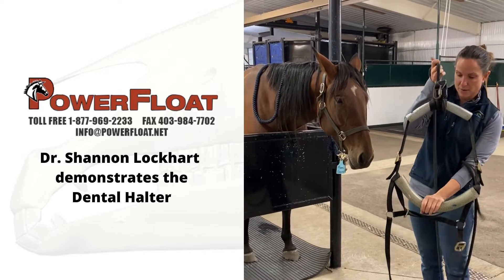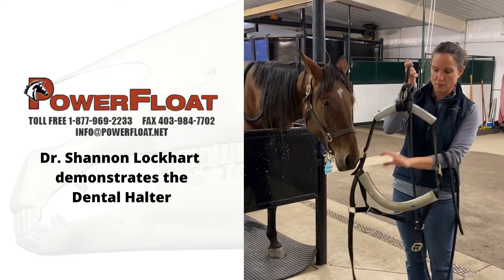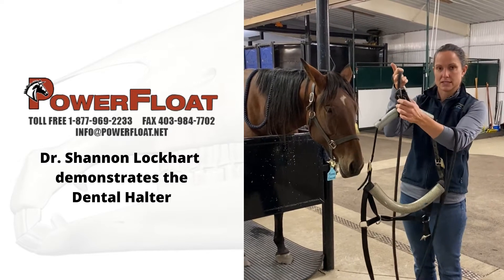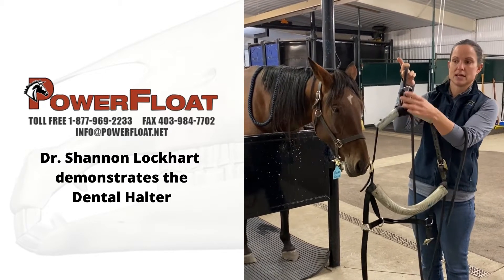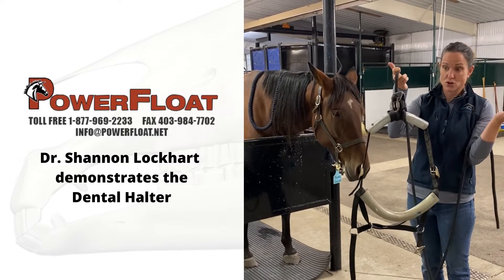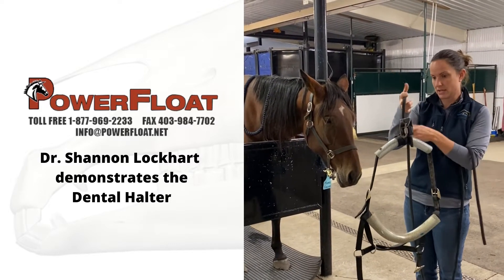It's a polyethylene enforced rod in the top and bottom just to be able to support the head once it's in there. This is a cleat — this is what keeps the head up and you put your rope through. I'm just going to show you how I use it on a sedated horse.